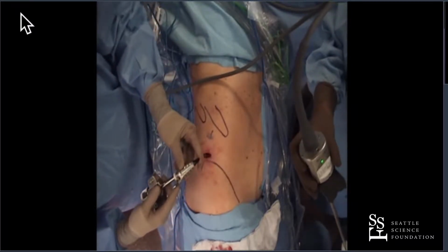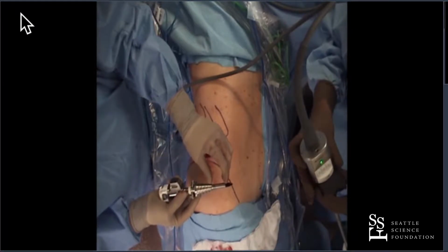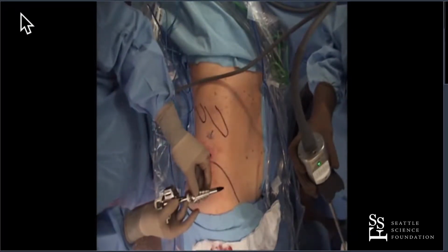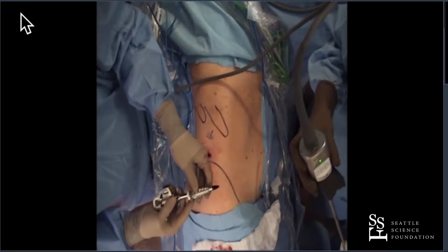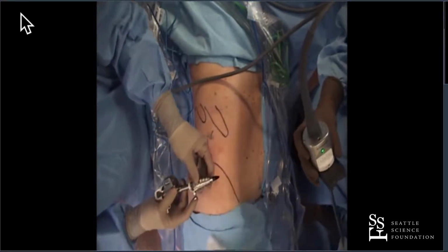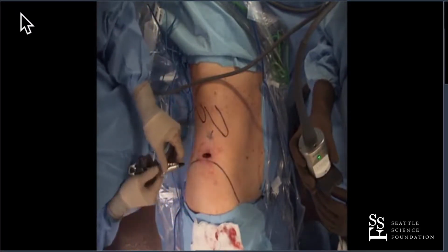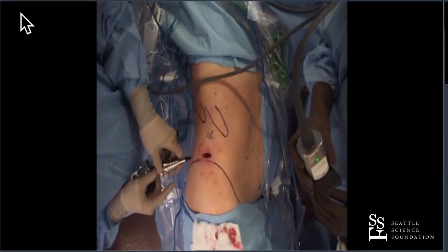So remember, this is a small space, so if you've got it in like that, you might be in too far, and what that does is it decreases your field of view. So I pull this back just a bit, and we do this inside the body, and I'll show you how we do that. It's a little trick. But we do this inside so that we have the maximum field of view with this port. Putting it in initially, I'm just going to kind of go somewhere in the middle here.